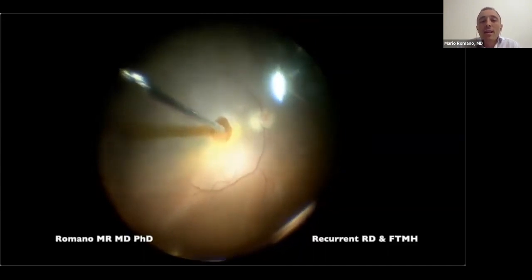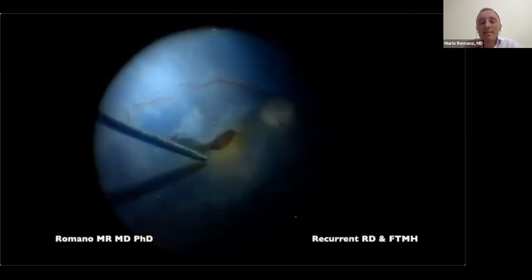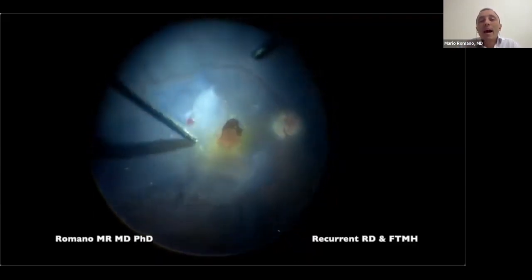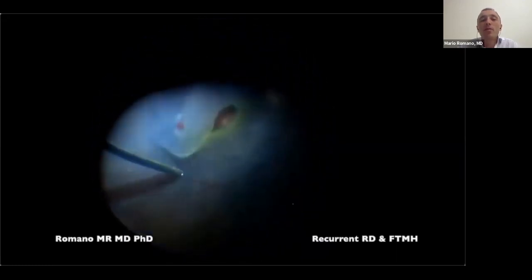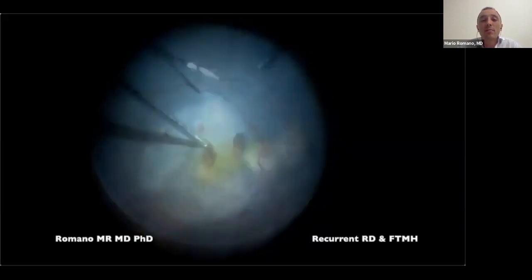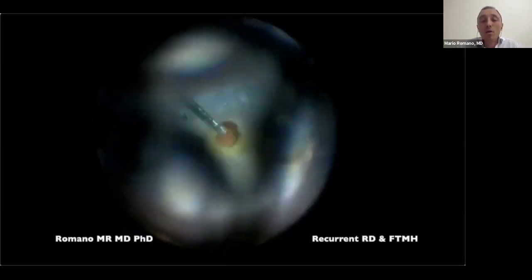Because the air has an interfacial tension of 70 millinewton per meter, by injecting air first, the amount of fluid that will go through will be less. And then I'm starting without putting perfluorocarbon liquid, because still I am not happy to have perfluorocarbon liquid during this maneuver, because probably some of the perfluorocarbon can go through. The hole is quite big and the retina has a very strong adhesion with the membrane. So after the peeling, I want to close this hole somehow. And you see the hole is quite big.